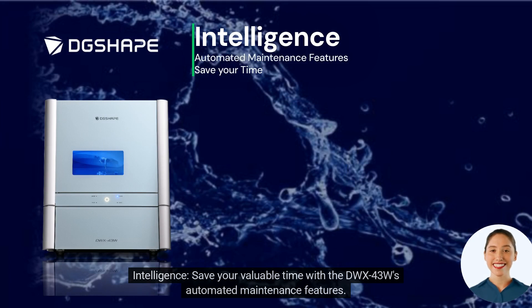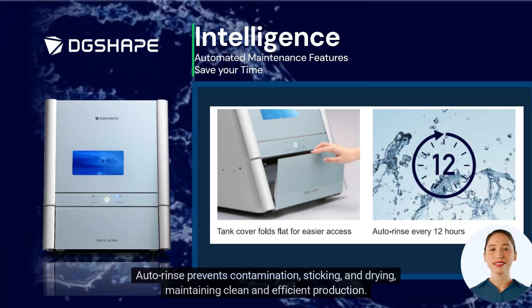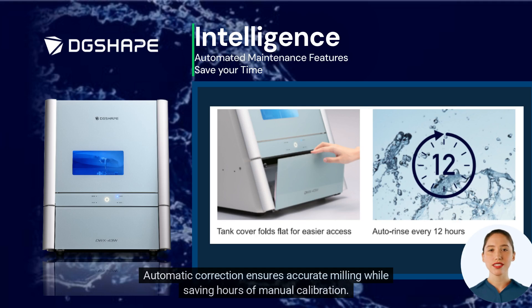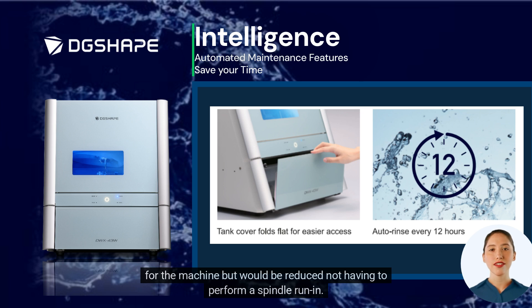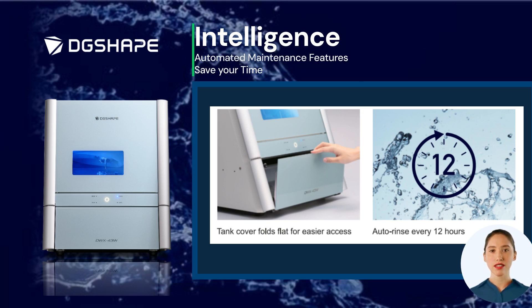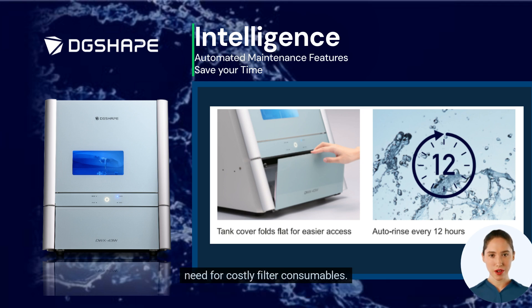Save your valuable time with the DWX43W's automated maintenance features. Auto rinse prevents contamination, sticking, and drying, maintaining clean and efficient production. Automatic correction ensures accurate milling while saving hours of manual calibration. Collet maintenance and coolant flow check are still required daily, but daily maintenance is reduced since there is no need to perform a spindle run-in. The improved water flow system keeps milling burrs and other device parts cleaner for longer, with no need for costly filter consumables.